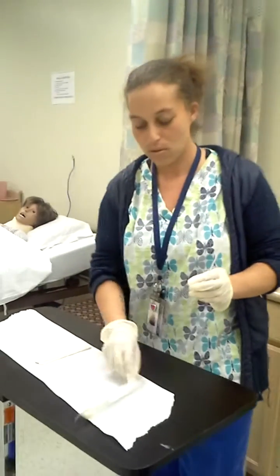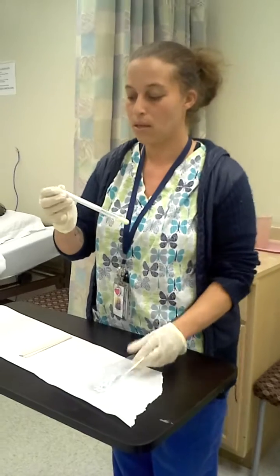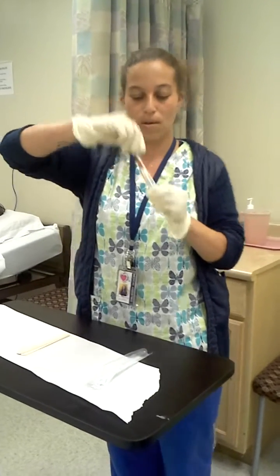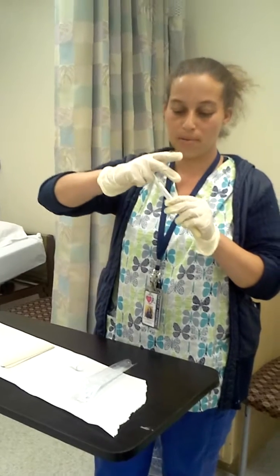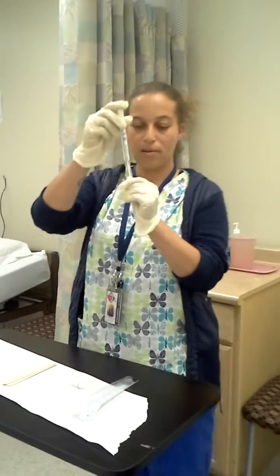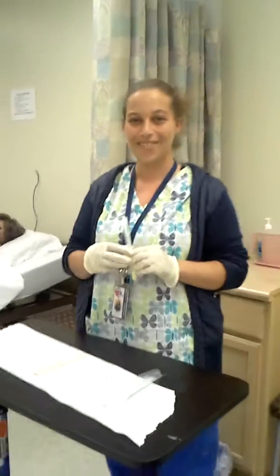Now we're going to go back to the culture applicator. We're going to snap it, put your cotton swab down, and press the vial to saturate the swab. And then you're all done. Thank you.